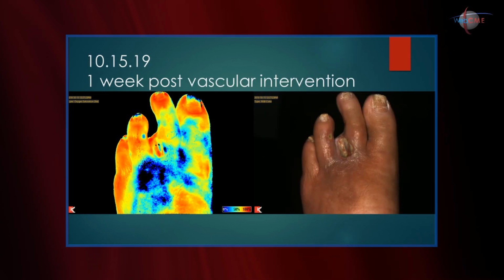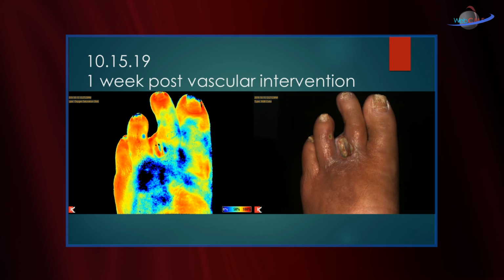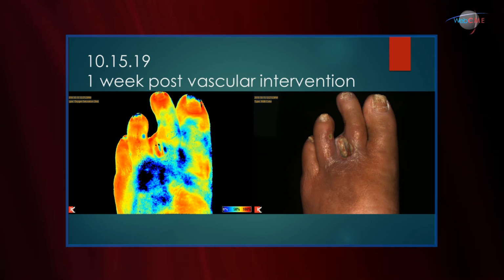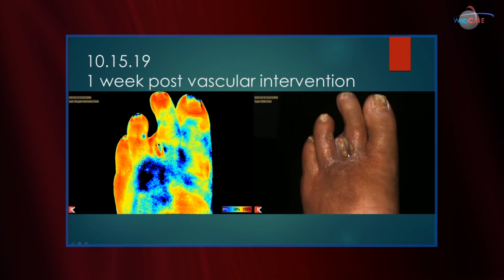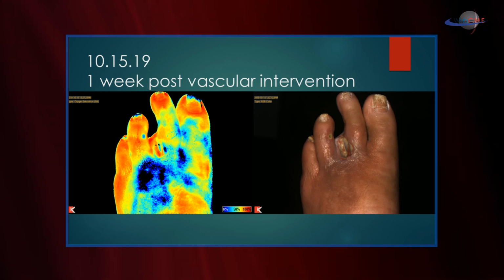Following the endovascular intervention, 1 week later, John, what are we seeing here? We're seeing a very significant increase in the oxygenation of the digits in the foot as well as the wound bed. And if you look at that, John, there's less ischemia, there's some early granulation, so clearly this snapshot camera with near-infrared spectroscopy is correlating very nicely to what we're seeing clinically.